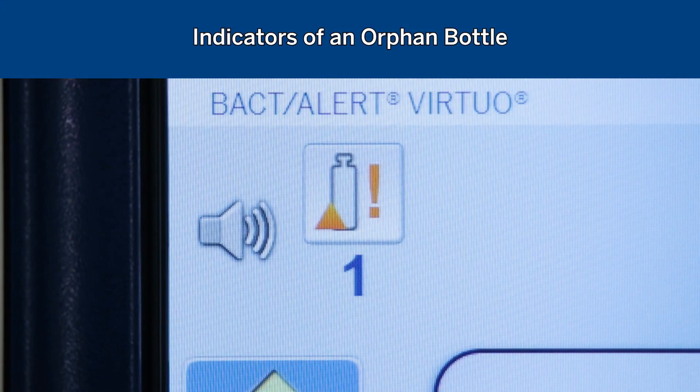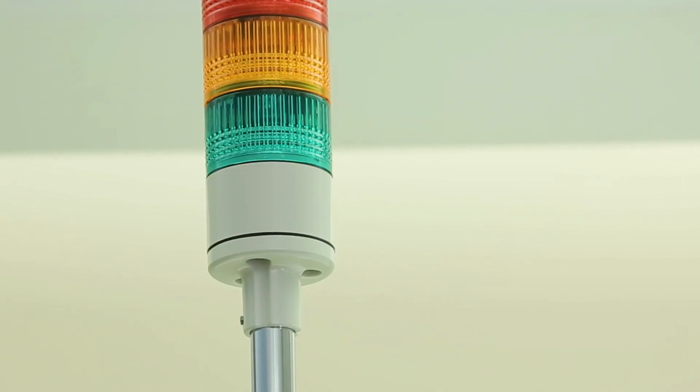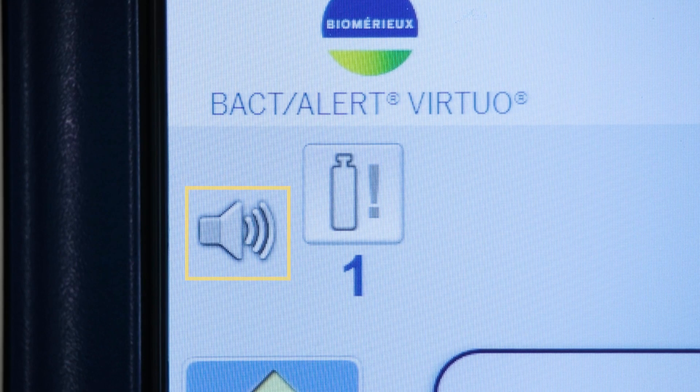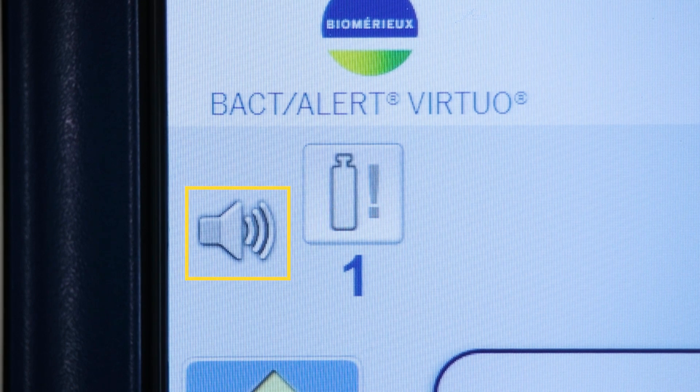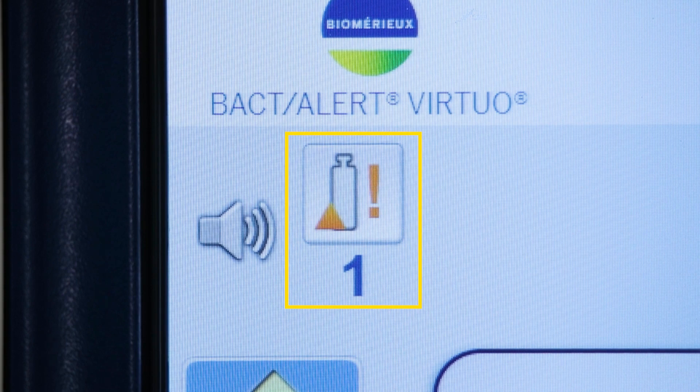Indicators of an orphan bottle: When the BactiAlert Virtuo determines a bottle to be an orphan, the user will be alerted in several ways. Blinking green lights on the warning tower and system status indicator, an audible alert if configured, and a bottle alert indicator on the large display screen.